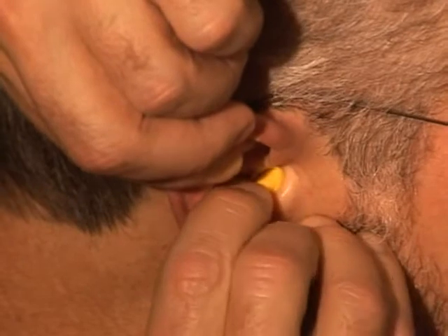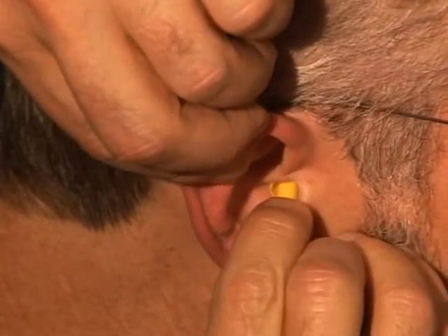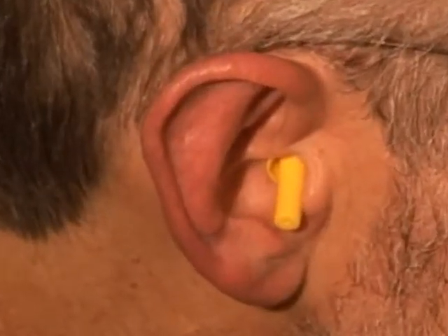Also, depending upon your ear canal shape and texture and your familiarity with the plugs, it can be helpful to moisten the plug before you begin.